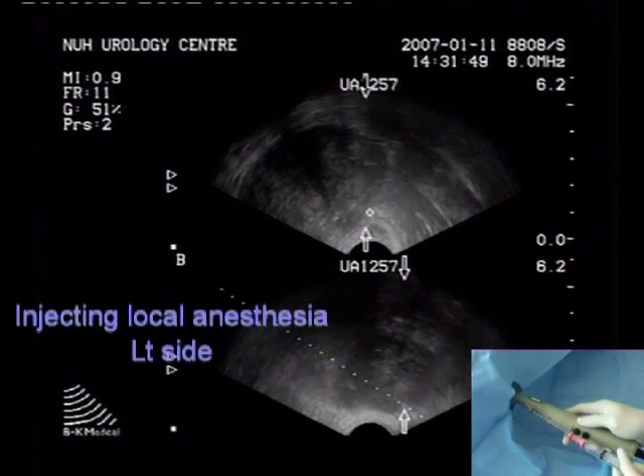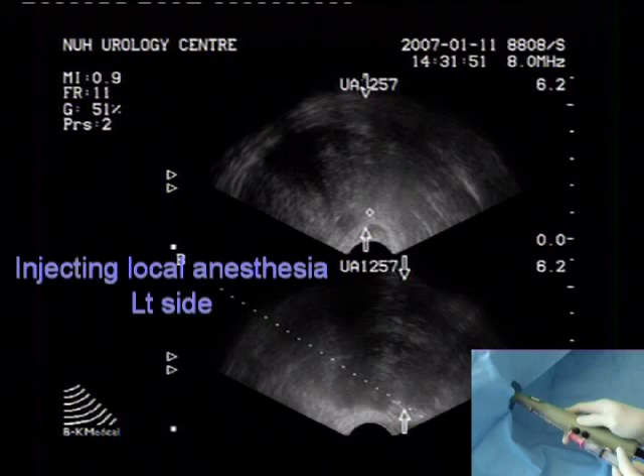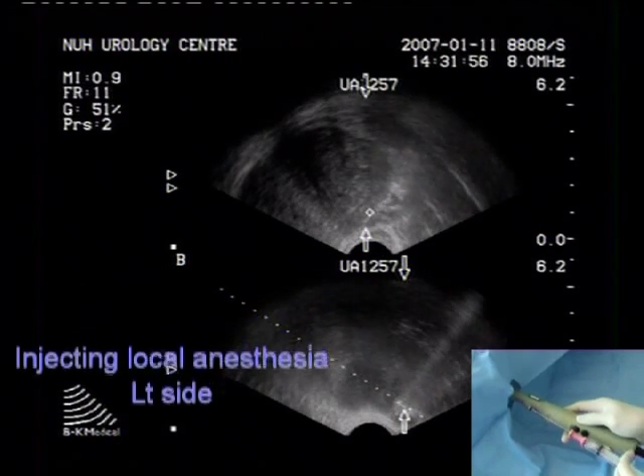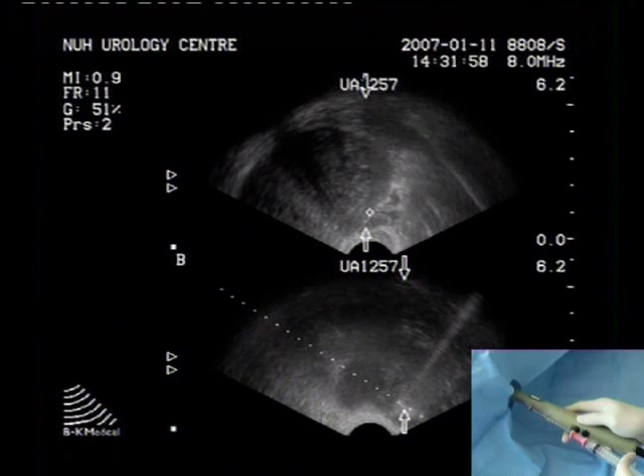Proper positioning of the needle tip is confirmed by observing the deposited local anesthetic solution causing separation of the prostate and seminal vesicle from the rectal wall.